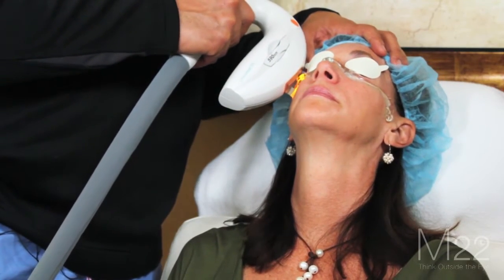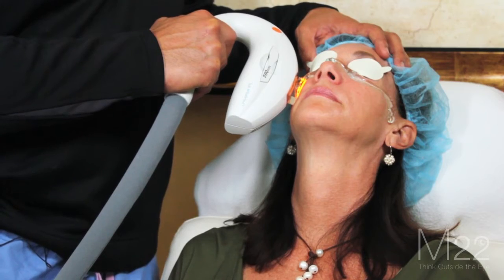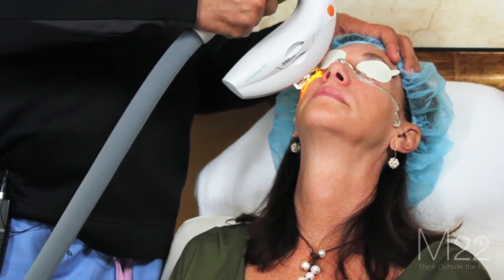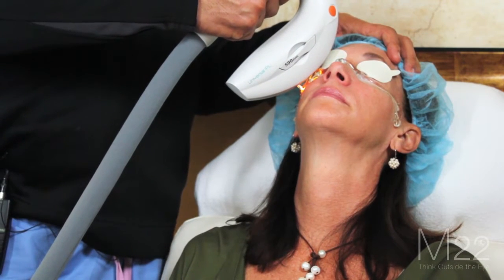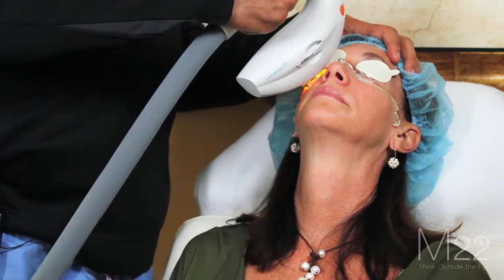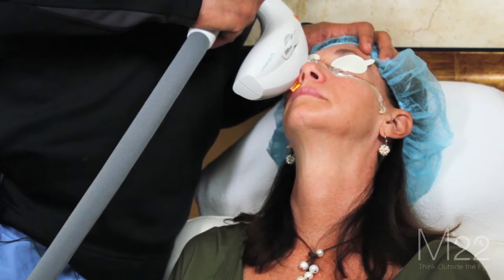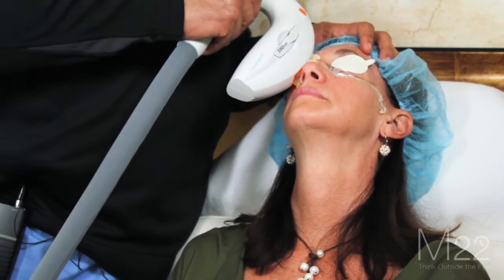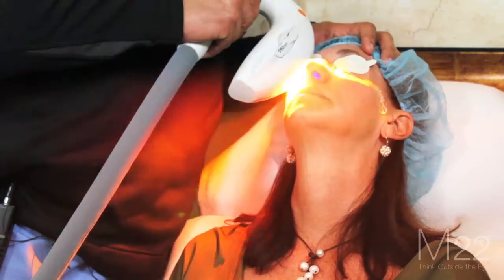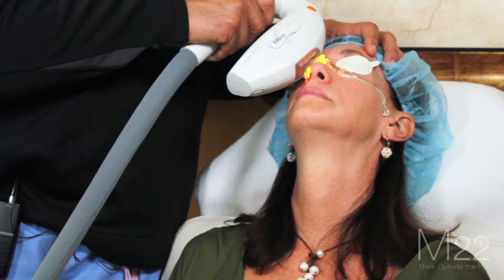This usually takes me about five minutes to do a double pass. As you can see, I'm doing the cheek. The important treatment area is right here on the lid margin. Usually it's about four treatments with mild overlap so that you get the full lower lid margin.